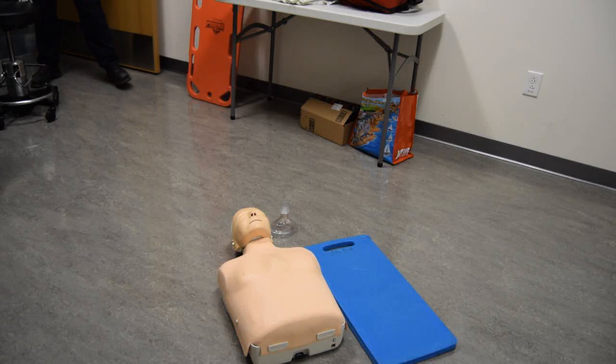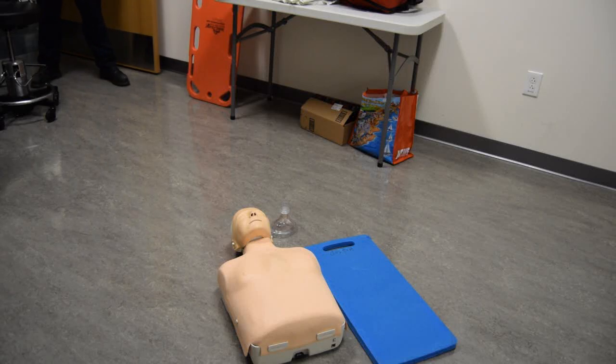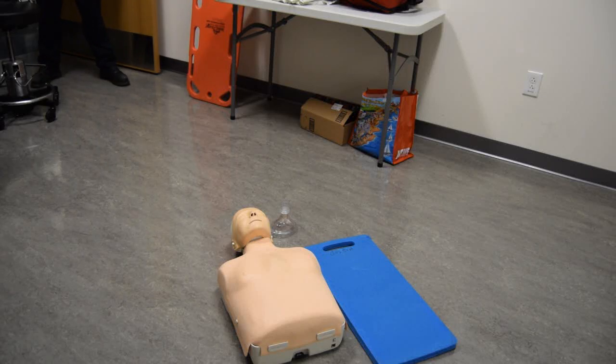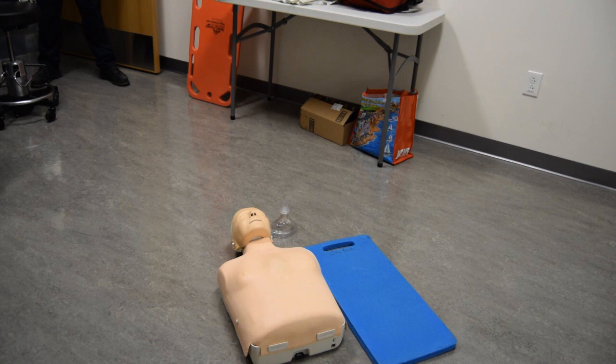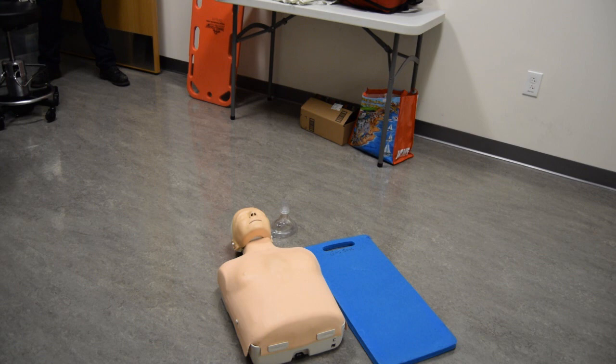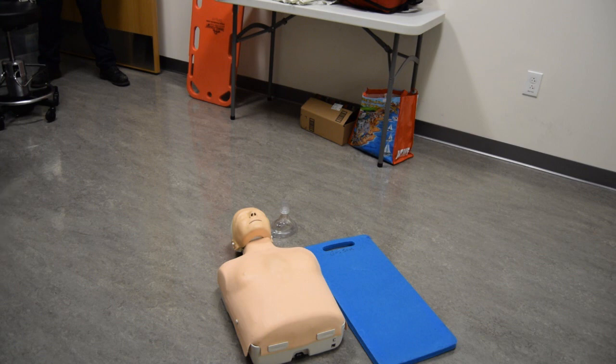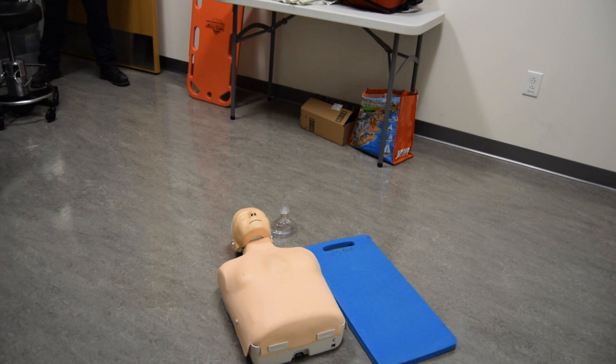Cardiac Arrest Management AED. This skill is designed to evaluate your ability to manage an out-of-hospital cardiac arrest by integrating patient assessment and management skills, CPR skills, and the usage of an AED.